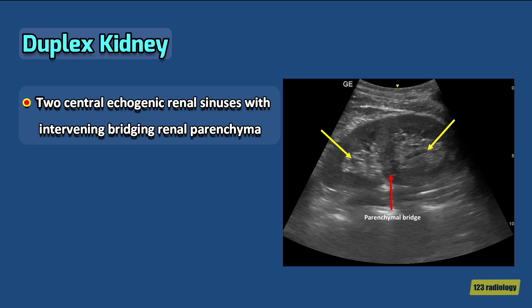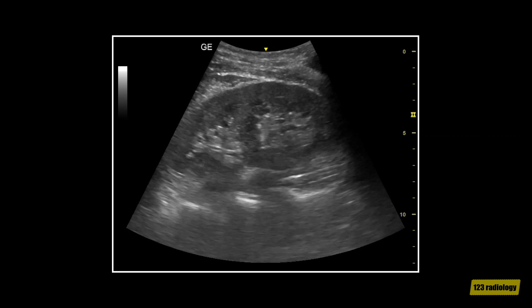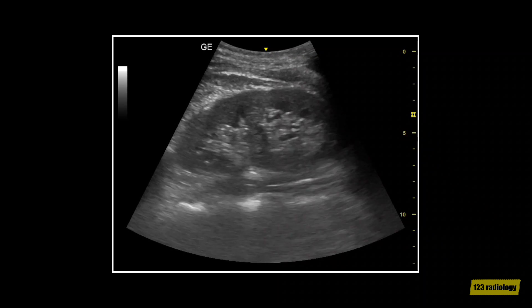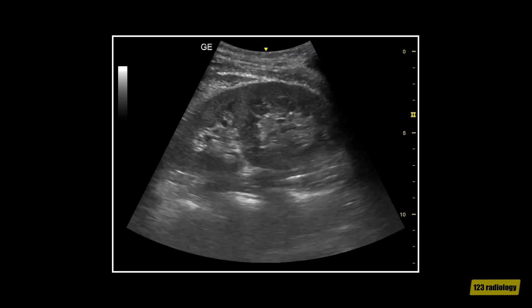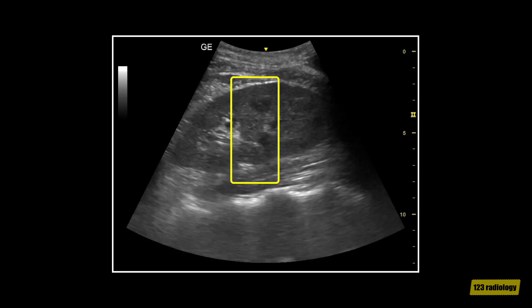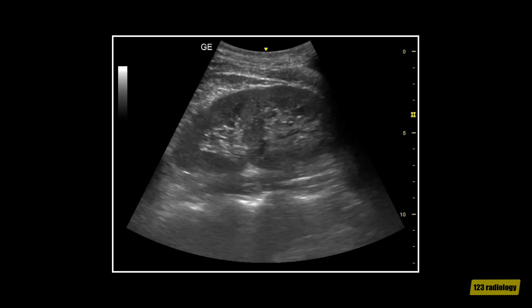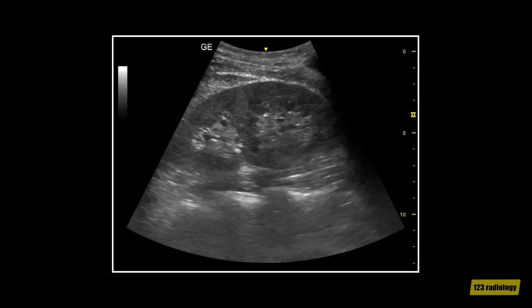On ultrasound, the duplex kidney appears to have two central echogenic renal sinuses with intervening bridging renal parenchyma, as you can see in this image. This is a cine clip of a longitudinal ultrasound examination of the left kidney. It shows the absence of hilar fat in the mid-pole of the kidney with a complete band of renal cortex, which in this patient is diagnostic for a duplex kidney.